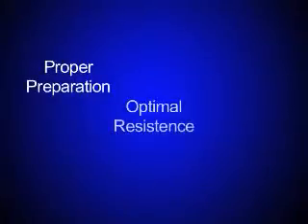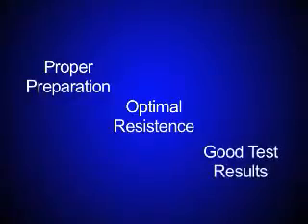It is very important that you explain to your patient that all preparation steps, including shaving of hair, skin exfoliation, and cleansing the sites with alcohol, must be done. Proper preparation will assure optimal resistance between the skin and the electrode, and optimal resistance is necessary for good test results.